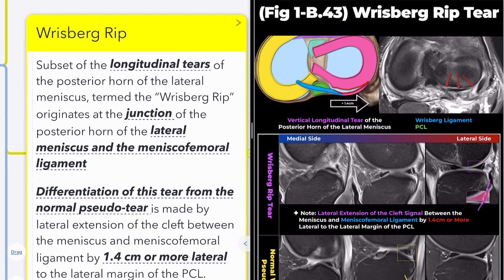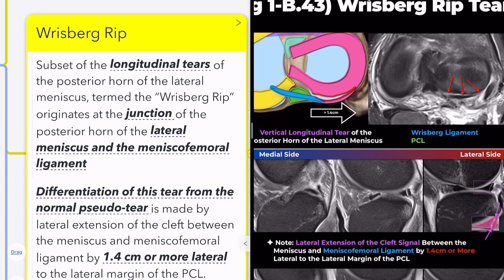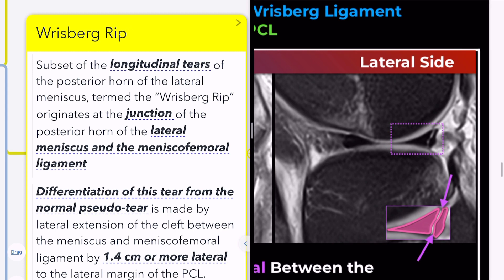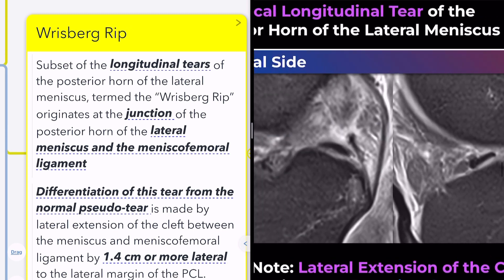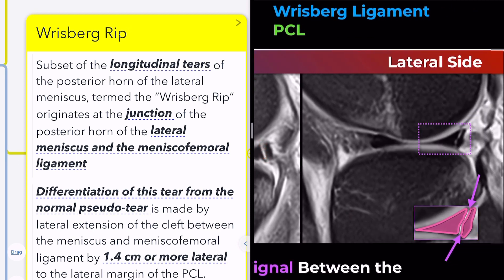The Risberg rip tear is a subset of longitudinal tears of the posterior horn of the lateral meniscus, originating at the junction of the posterior horn and the meniscofemoral ligament. Therefore, on a sagittal image, the vertical high signal intensity resulting from a peripheral longitudinal tear continues continuously from the junction of the posterior horn and the meniscofemoral ligament to the point where the fibular head is visible.